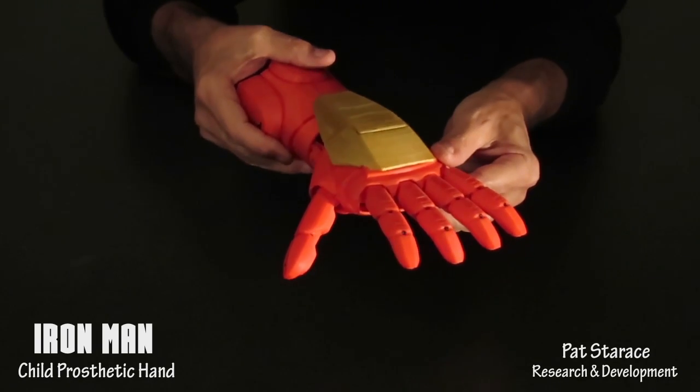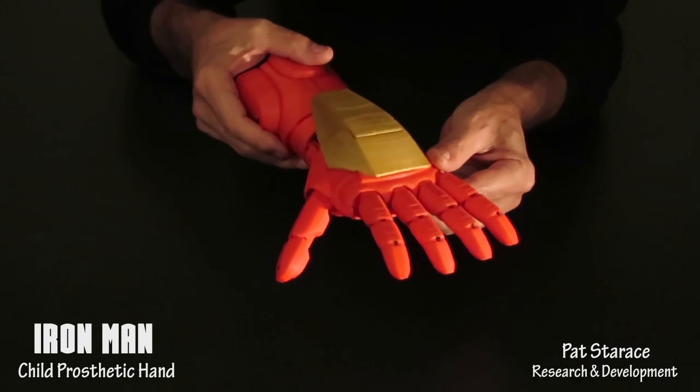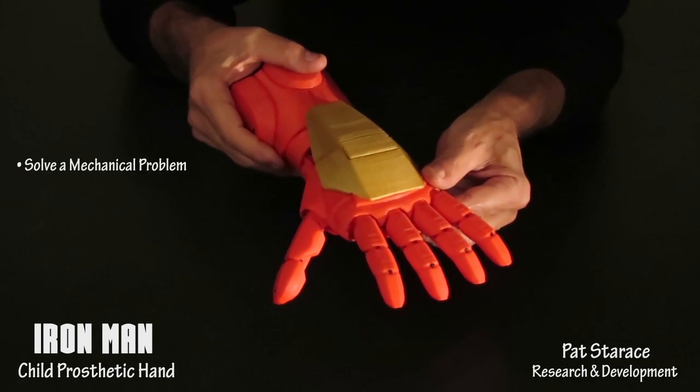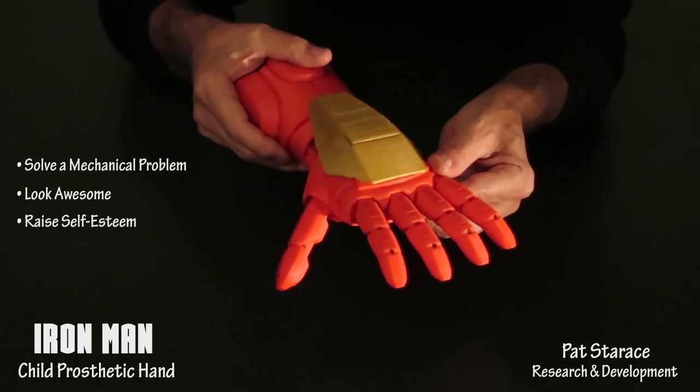This is a demo of a 3D printed Iron Man child prosthetic hand. The main objective was to create a hand that could help a child by solving a mechanical problem, looking awesome, and raising their self-esteem to superhero levels.